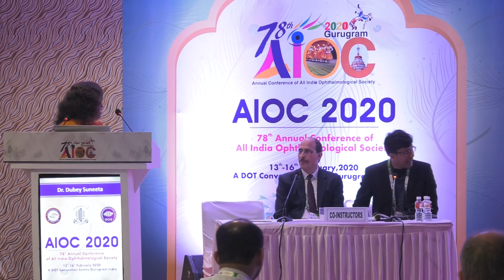I think that's the main thing. So I prefer sulcus placement if possible. Sulcus versus the anterior chamber, what would you prefer? Pseudophakics, probably. I mean, depending on the anterior chamber, of course.